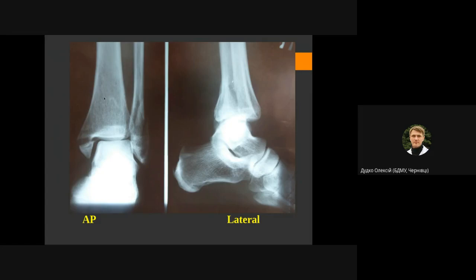First of all we should check and find possible fractures. We go along the cortical layer, and if we have a disruption of this cortical layer, we can see the fracture. Here we can find a fracture of the medial malleolus, and we have a gap between bone fragments which indicates some displacement.